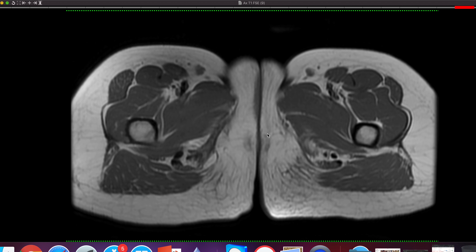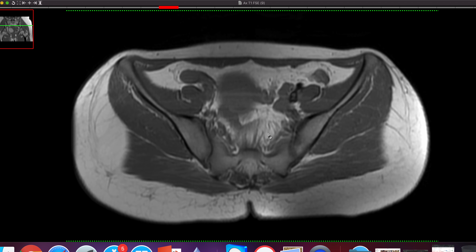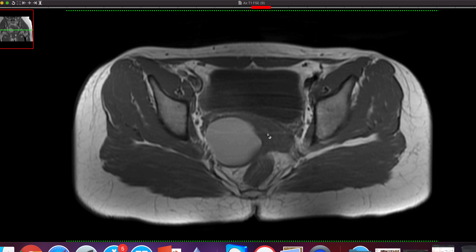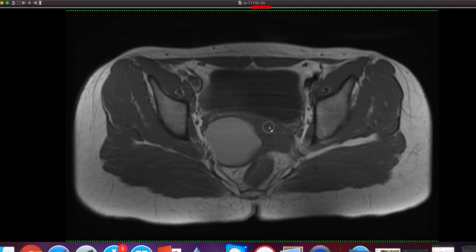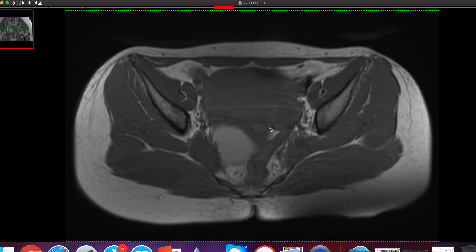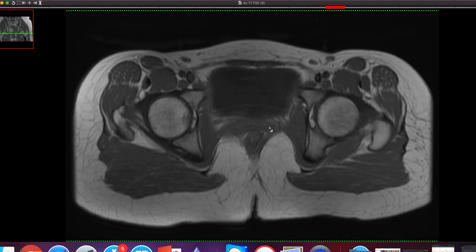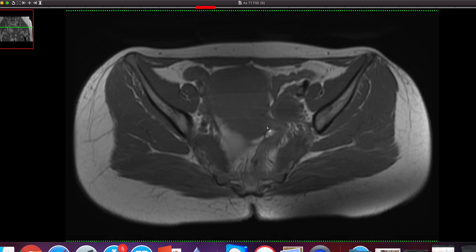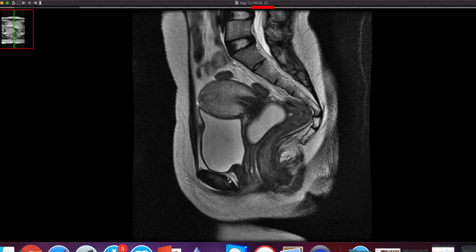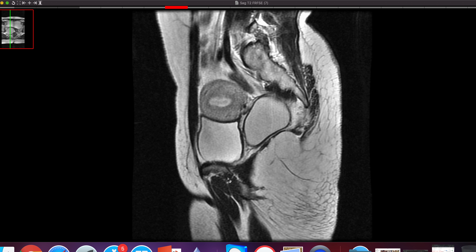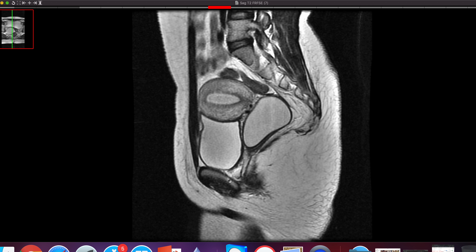The cyst is hyperintense, consistent with mucoproteinaceous content arising from the vaginal walls. Based on these findings, we have concluded the cyst is a Bartholin cyst.